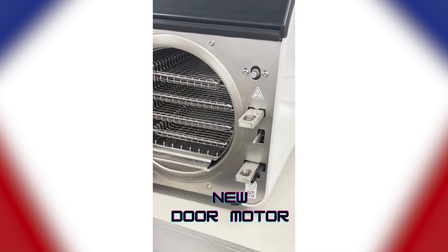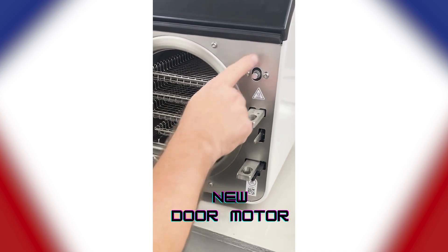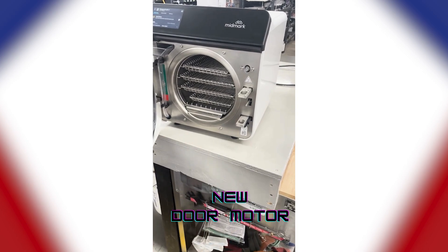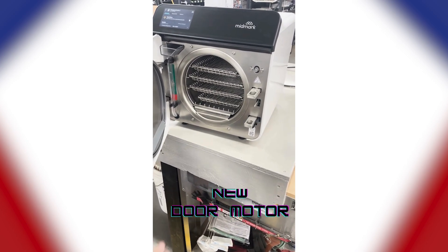They did a big change on the door motor, which I like a lot. It's more like a piston — it pushes the door out. I saw the door operate and I like the way the door opens up.